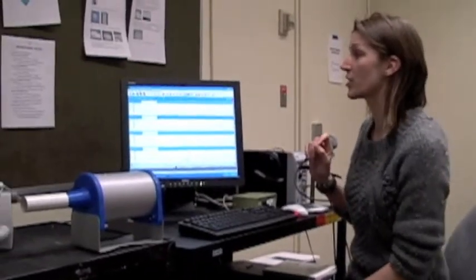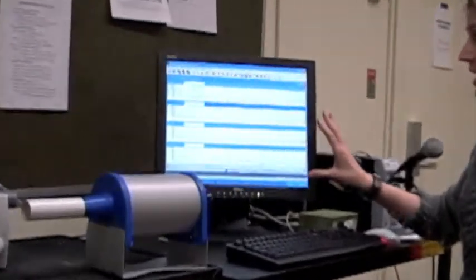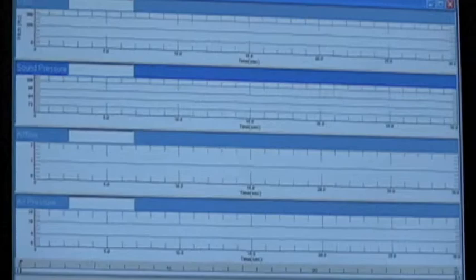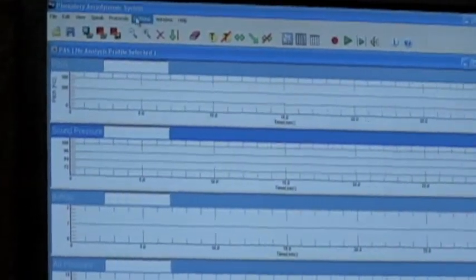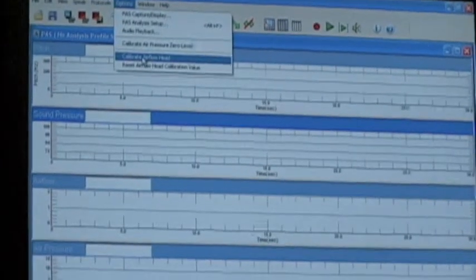When you first enter the phonatory aerodynamic system, it will bring you to this screen here. It may ask you to calibrate the device. If it doesn't, you can make sure to do so by going to the options menu and down to calibrate airflow head.